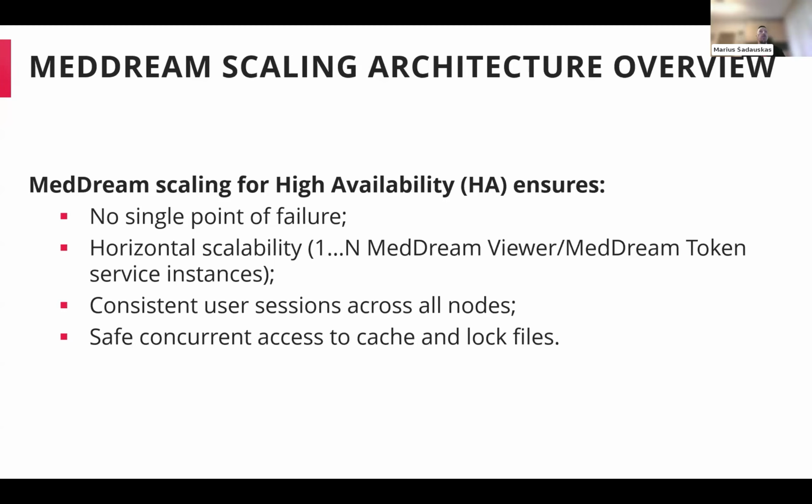And MedDream scaling for high availability in principle ensures that there will be no single point of failure, and the MedDream and the MedDream token service can be scaled horizontally. So from one to many MedDream nodes or MedDream token service nodes could be running at the same time.